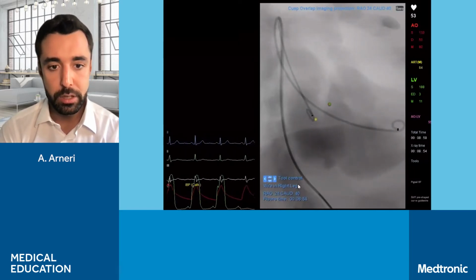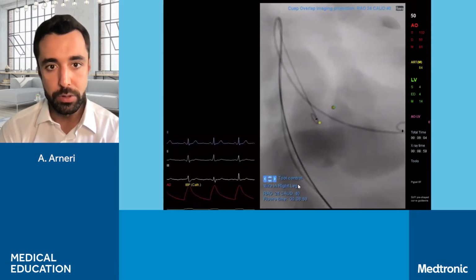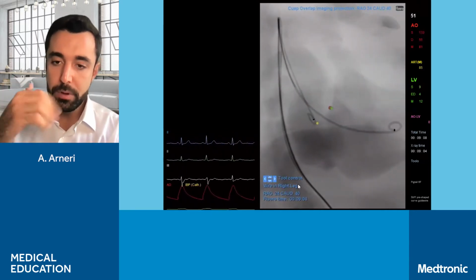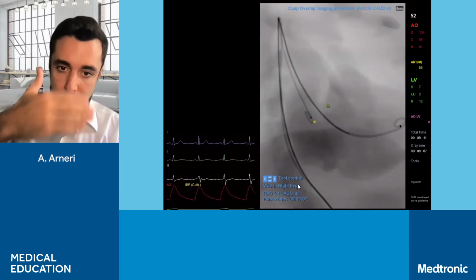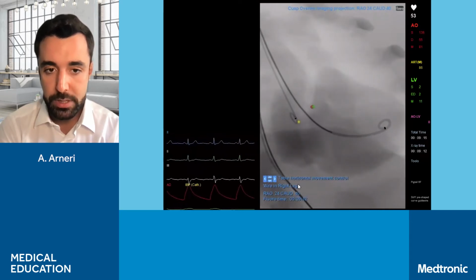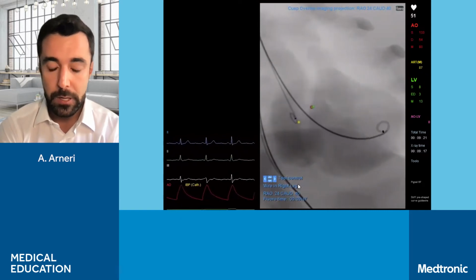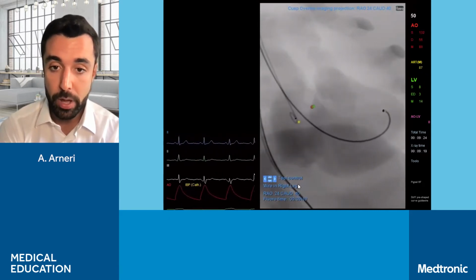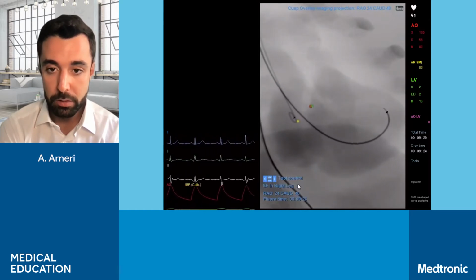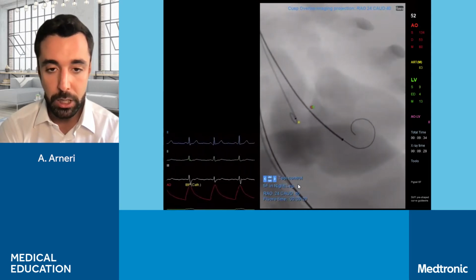And we will insert the pre-shaped guide wire through the pigtail that we have now in the ventricle. Because of the shape now of the tip of the pigtail, the wire will go out freely. Also, for this new cusp overlap technique, a Landerquist wire is suggested because it's more supportive and helps a lot with this new technique. So either Confida or Landerquist C-curve guide wire are suggested.